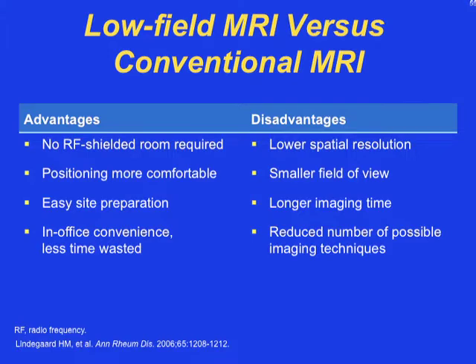The comparison between low field versus conventional MRI is listed there. We've discussed this at previous meetings, but I think from the perspective of what you're going to be utilizing it for in your practice. And Stephen Adele, when he gives his talk, always shows the picture of the Mona Lisa that's a little blurred. From our perspective, we have enough value in a low field MRI to pretty much make all the diagnostic and treatment decisions that we need.